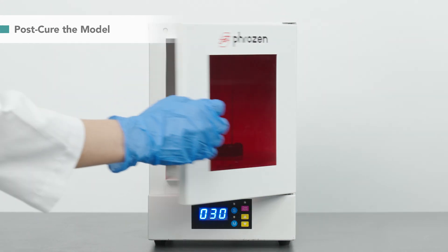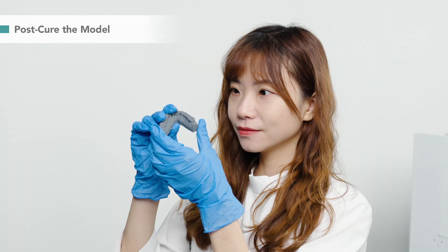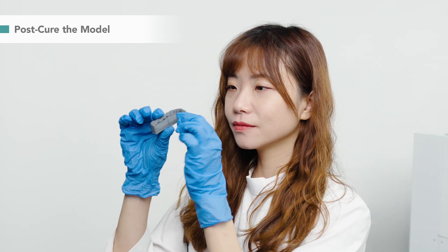30 minutes have passed. Let me check it. Okay, it's ready for thermal forming.